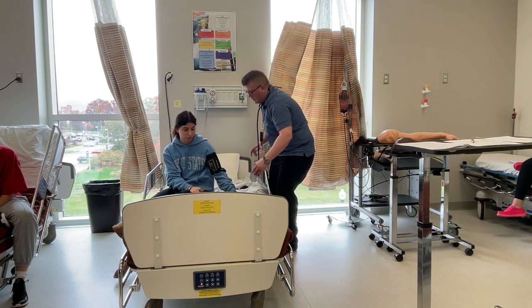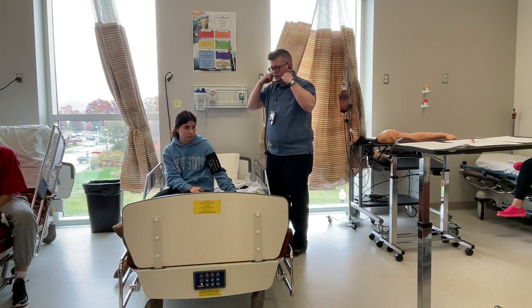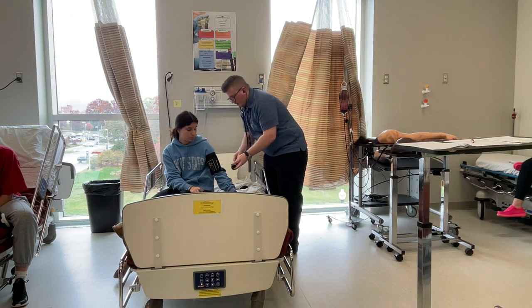Okay. So I didn't feel it anymore at 120, so I'm going to puff it up 30 points ahead of that 120. That'll be my starting point.